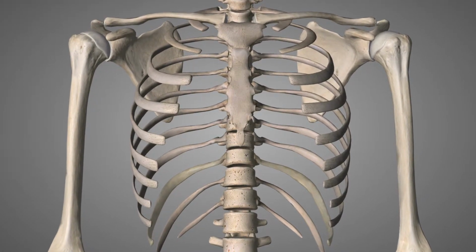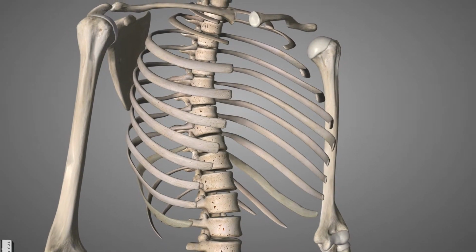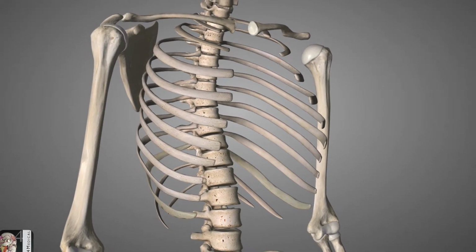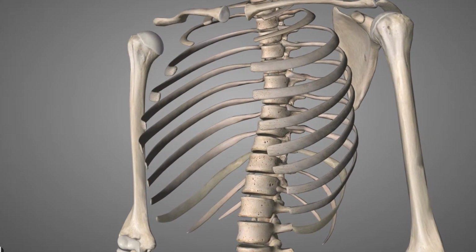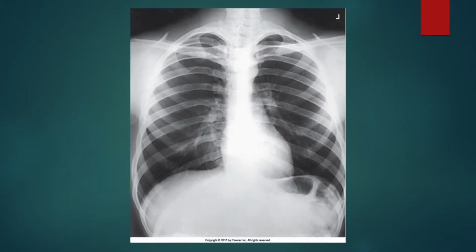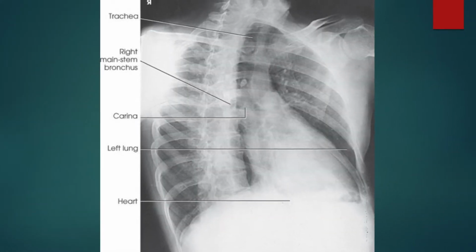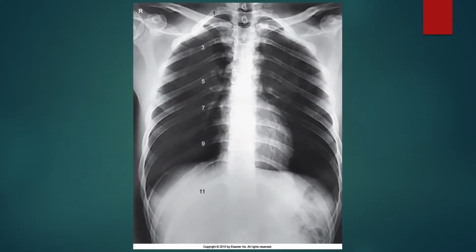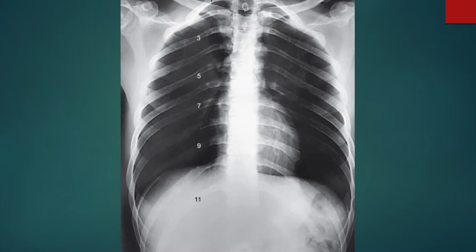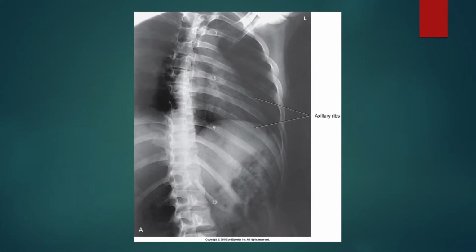And when you go to oblique your patient for an AP projection of the ribs, you're going to turn the affected side toward the IR. For example, if your patient is having left anterior rib pain, you're going to put them in an RAO. But if it was left posterior rib pain, you would put them in an LPO.